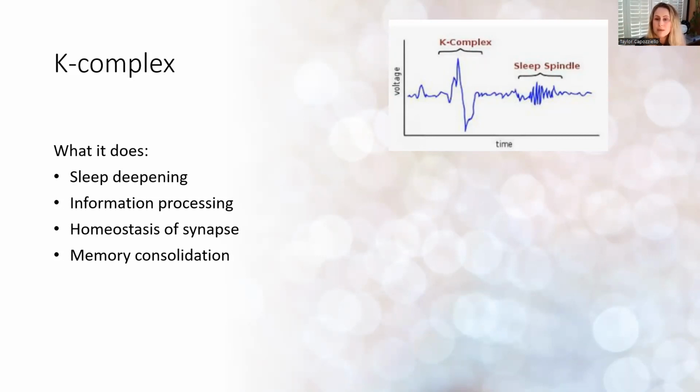It's in the delta band because most ERPs are going to trigger a delta band filter. And there is a difference between spontaneous EEGs and event-related potentials, but this is included in the summary in the raw waveform. It is a singular event. It's not a delta wave rhythm, but within the frequency. And I'm going to show you why in a little bit.